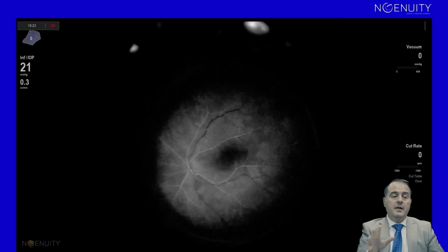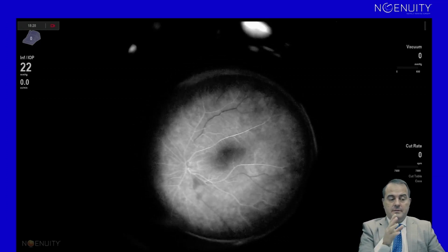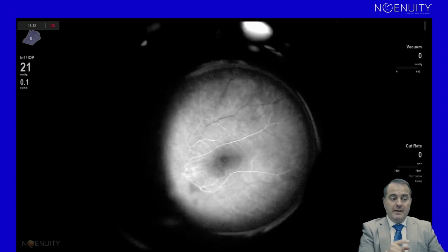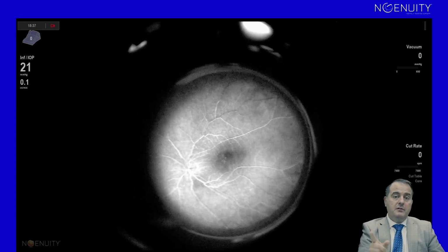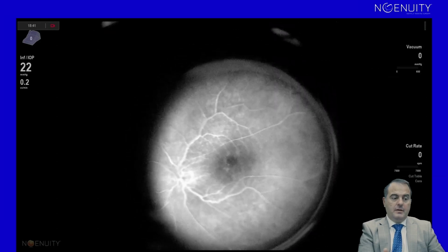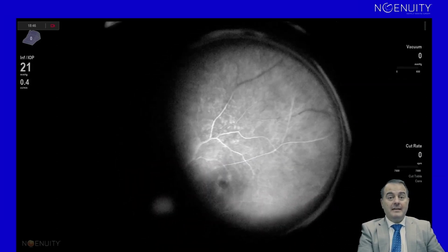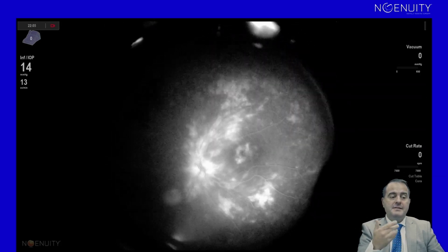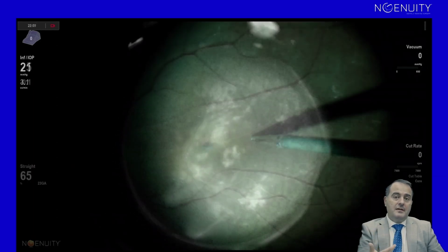This is a case of thick epiretinal membrane, and we found that in all these cases, in the intraoperative fluorescein angio, we have delayed perfusion of vessels, peripheral vasculitis, and ischemic areas. So the term idiopathic epiretinal membranes starts to lose the ground. Here, these are the late phases of the same patient, so you can see how much leakage is there.